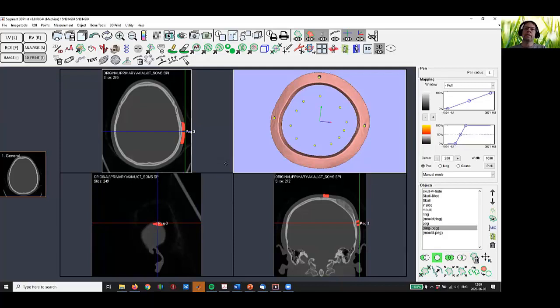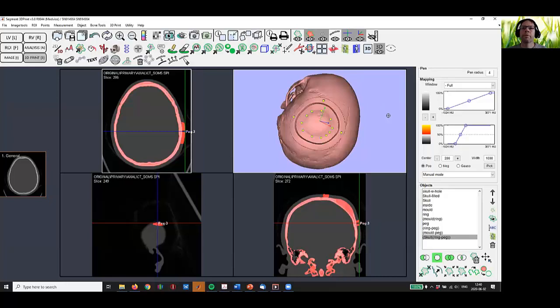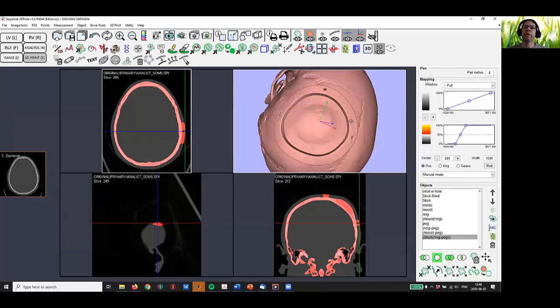And when it's fixated, draw a line on the skull and then use this line as a guide for making the cut into the bone. So if we put the ring together on the skull, it will look something like that. So when we open the skull, this is a bit how we will see. We put the ring and then rotate the ring so it fits on the planned CTs, and then we can remove this part, and then we have a ready mold for doing this.